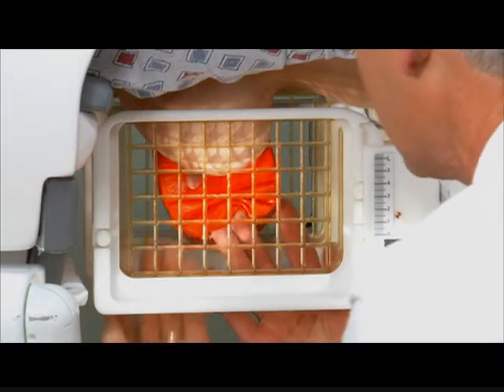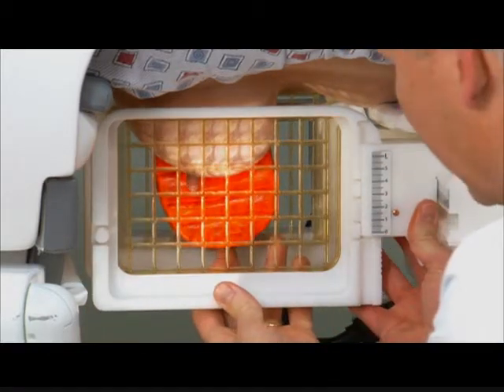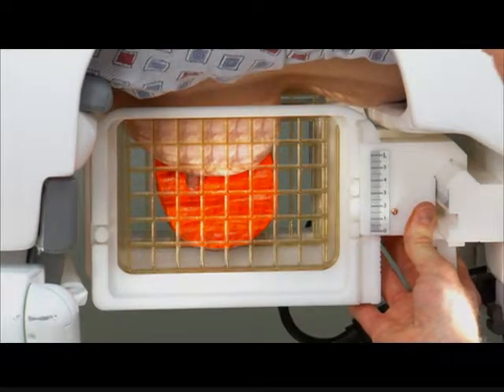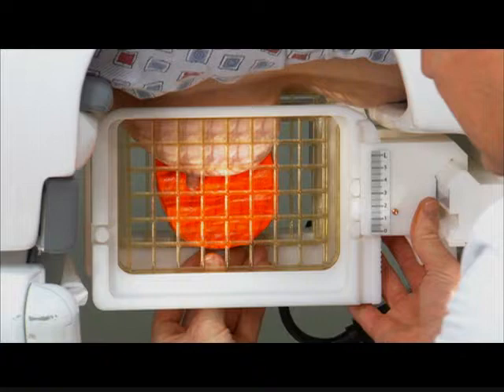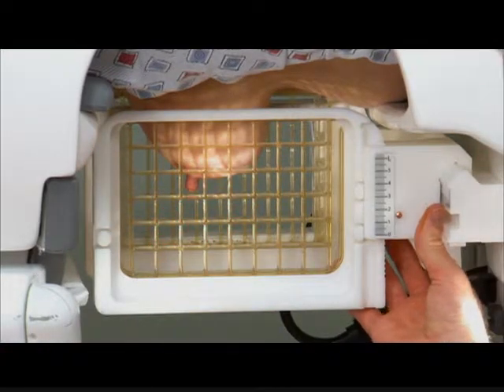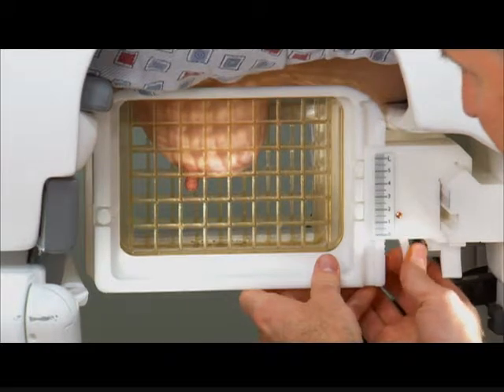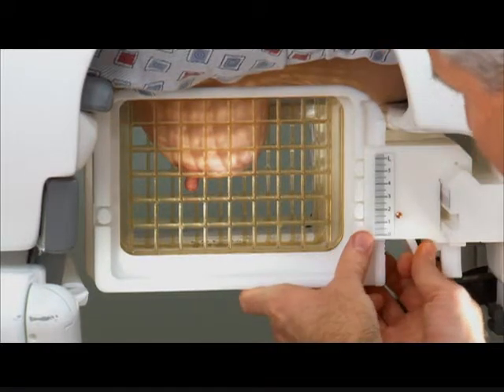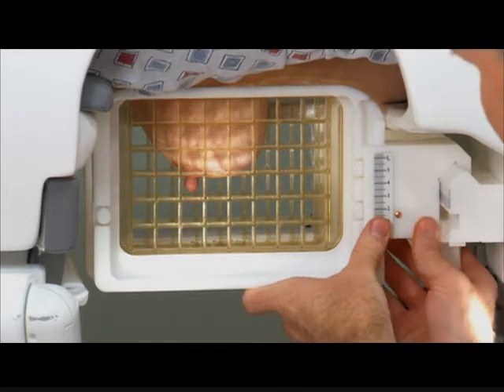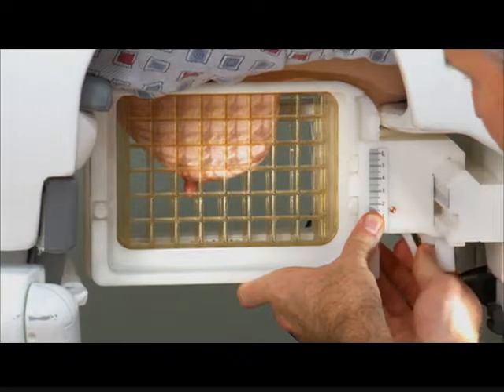If there's an anterior lesion, you either position the patient appropriately, or if you have grids that are mobile, you can position the grids to more optimally compress the anterior breast versus the more posterior breast. This is a somewhat mid lesion, positioned centrally within the breast as we cross-reference. You can see it's pretty much centrally located, so in this case you could do either a medial or lateral approach. In this particular instance, we chose a lateral approach.